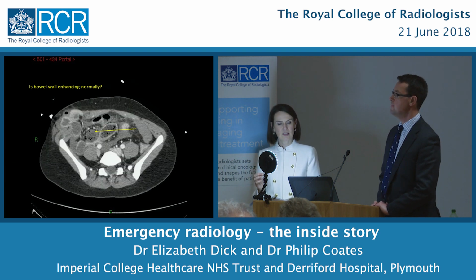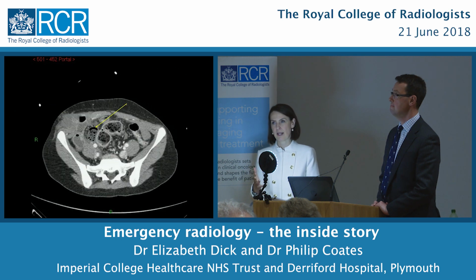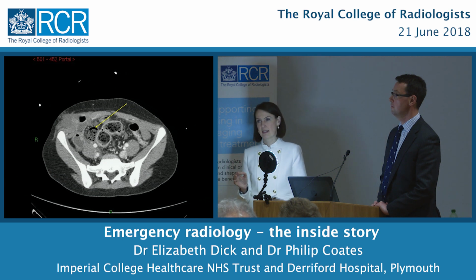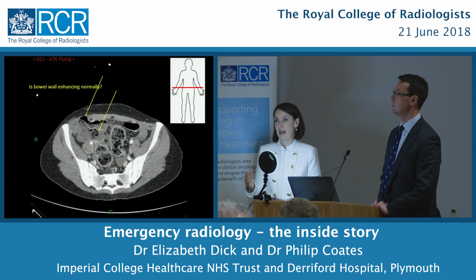So we say to the surgeons, look, we're very, very worried about this loop of bowel. We think there's no blood supply to the bowel. And this is really important because hours matter with dead bowel. The longer that you leave the bowel without addressing the problem of it being dead, the more complications you get.